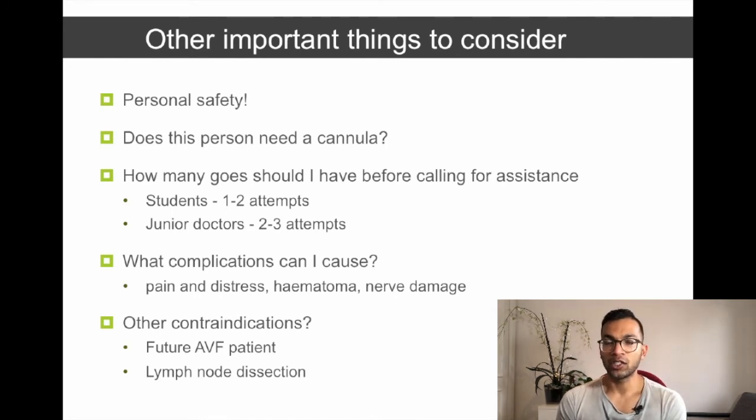There are some situations when you know a patient is very, very difficult for whatever reason, and you may call for assistance straight away, whether it's your registrar or consultant or your anesthetic department. Now, obviously, there's a lot of complications that you could cause, so really being mindful of this is worthwhile. Pain and distress, hematoma, nerve damage are just among the few things that you can cause.